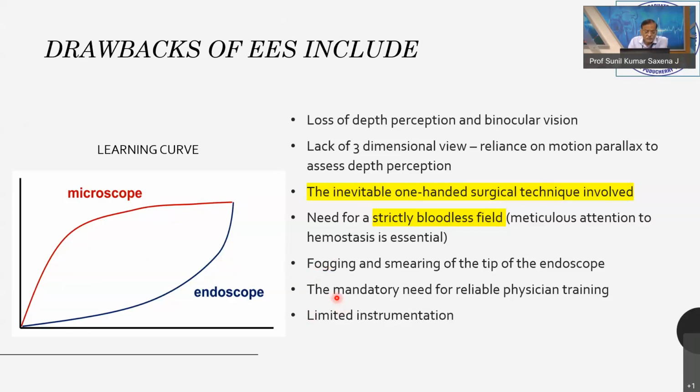Yes, it requires physician training, mandatory training, and on the left side is the learning curve. If you see the red, this is the microscopic learning curve, which is approximately 2 to 3 years. The learning curve of the endoscope is a little longer, 5 to 6 years. But if you have a good mentor, you keep on working hard, I think the same can be achieved. And the surgery you will do with the help of the endoscope, you won't be able to do with the help of the microscope.